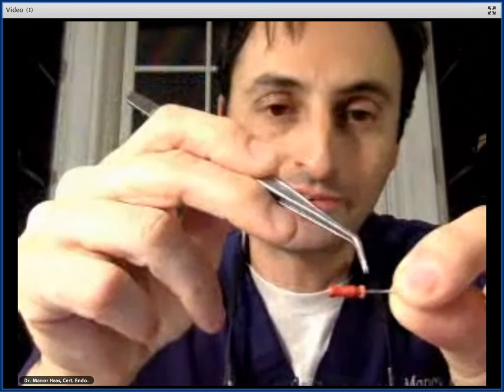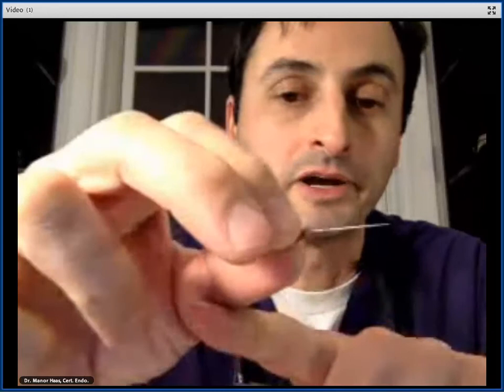Reuse it. And by the way, on this little thing, if you look closely, maybe it's tough to see on the internet, but there are little black notches on it. The first one is 18, then 19, then 20 millimeters, then 22. Tulsa, I have to say, is brilliant in doing this, where this is my ruler. Those little notches that you might see over there. There you go. You see those little black lines.